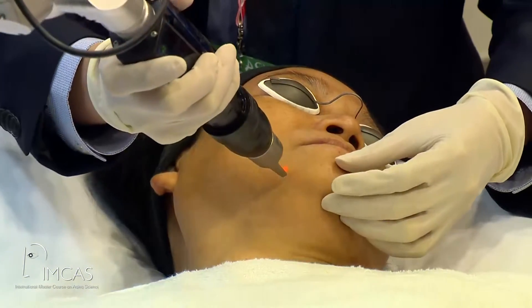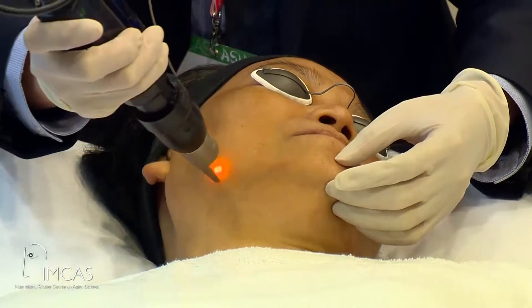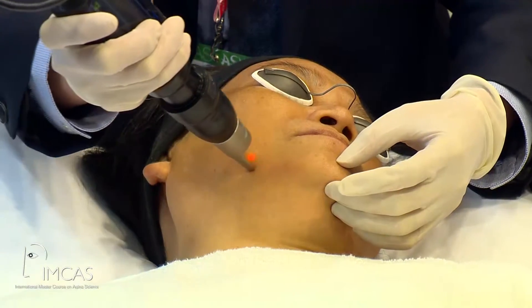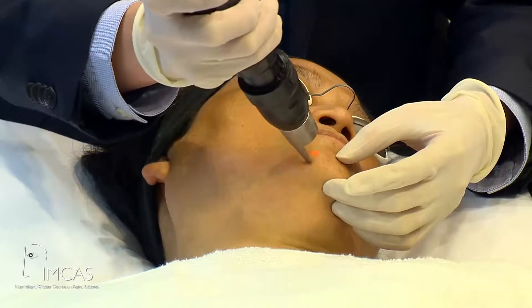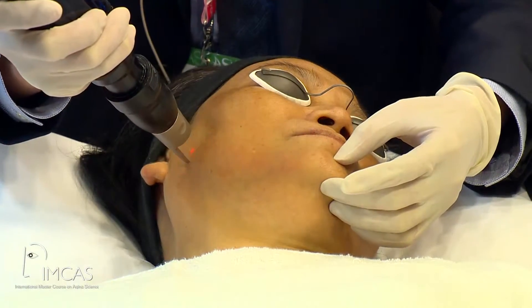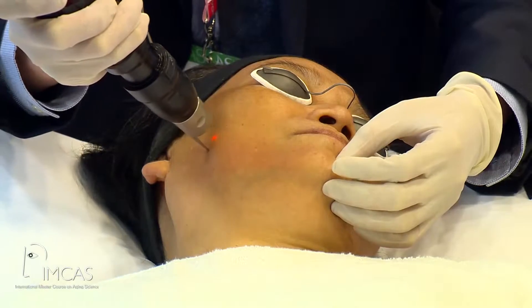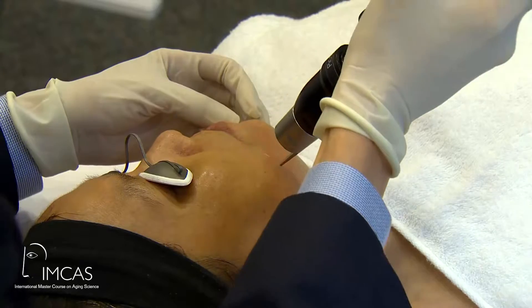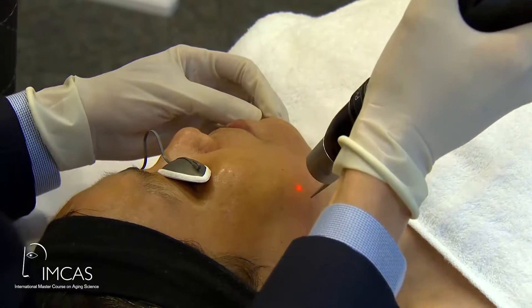That's the first time I saw how 755 looks. It's infrared — you don't want to see it. What I'm doing now, you could call this toning, but it's a little bit different because the energy is a little bit higher than what we would usually use with toning. The idea is to gently reduce the melanin loading on such a darkly-skinned face, but with lighter, this is not really high energy.